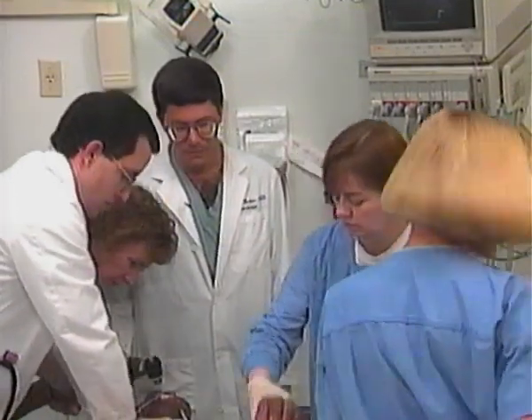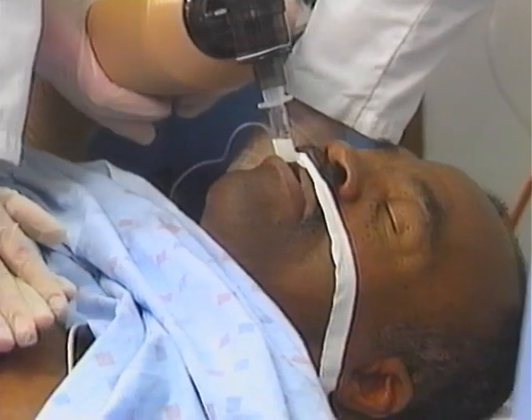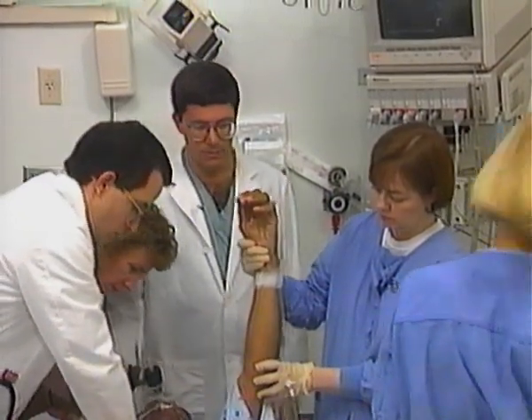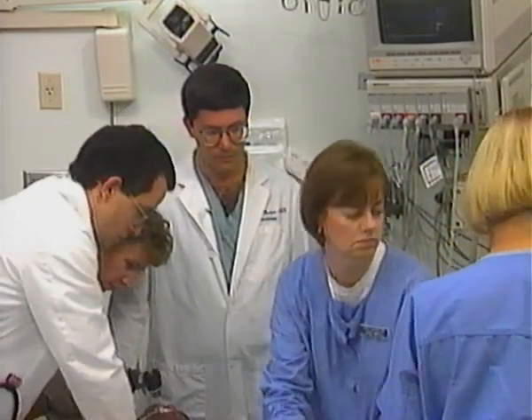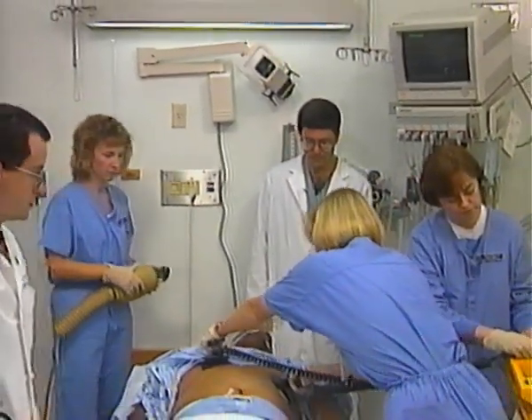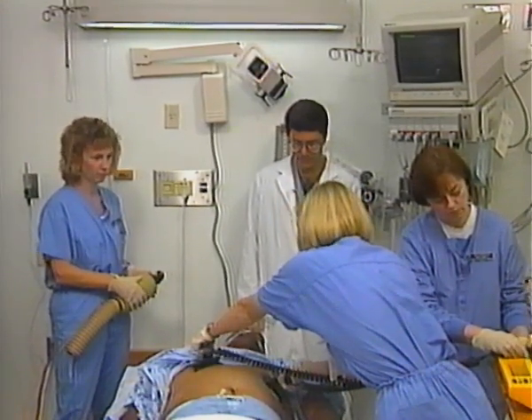Lidocaine's in. Okay. Let's go ahead and shock him again with 360. Charge to 360. Charged. 1, I'm clear. 2, you're clear. 3, everybody's clear. Shocking now.